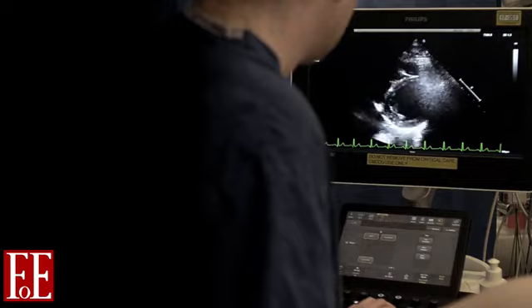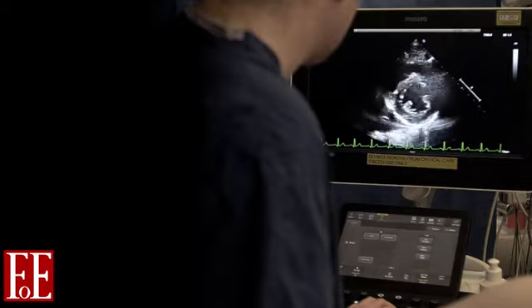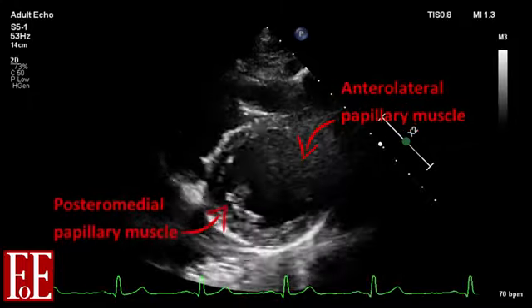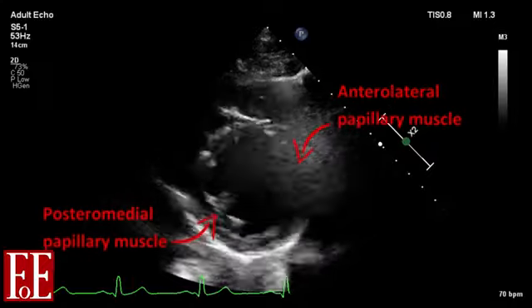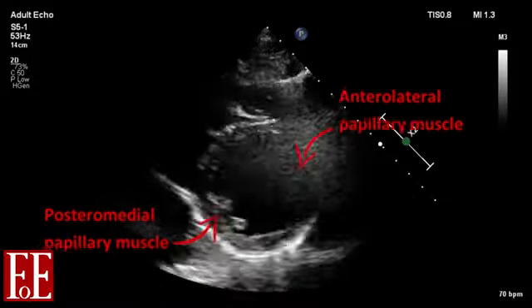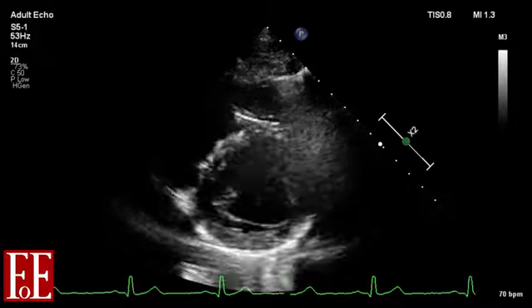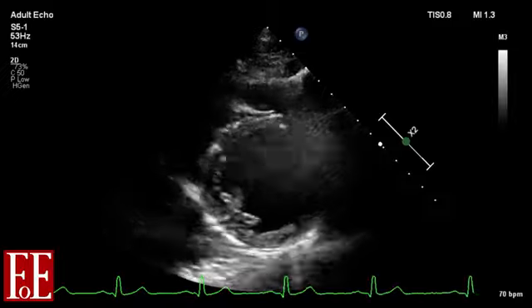As we pan further into the left ventricle, we start to encounter the subvalvular apparatus, so the chordae, and then projecting into the ventricle the papillary muscles. And what we want to do is follow the papillary muscles into the left ventricle cavity until they appear to be or are part of the left ventricular wall. So when we first encounter them, they'll appear to be floating, there'll be blood all the way around the papillary muscles, and then as we move further and further laterally with our imaging sector, we'll see that they form part of the LV wall. And that's where we're going to take our slice at the mid-level. Here we can get a sense of left ventricular radial contractility, and very usefully we can see all of the coronary artery territories in the same view.